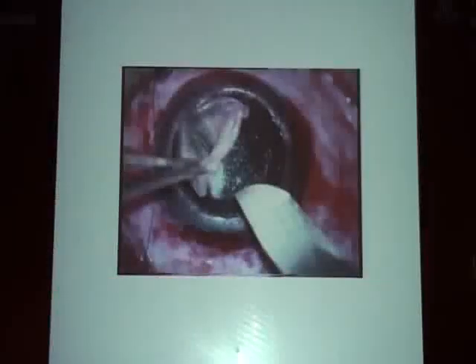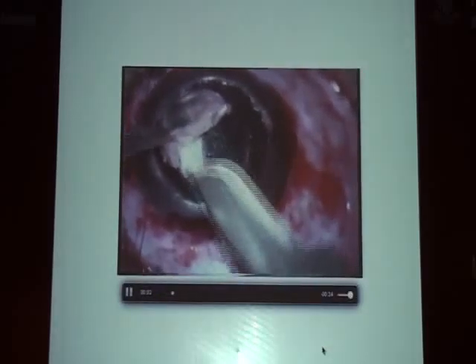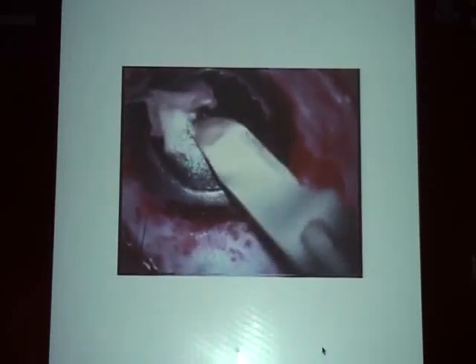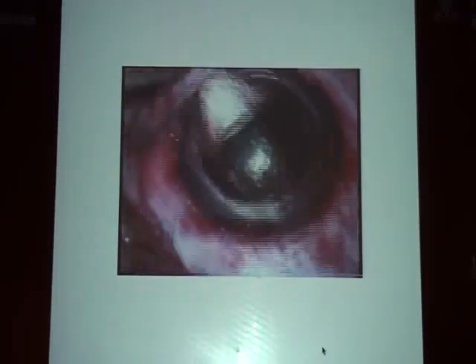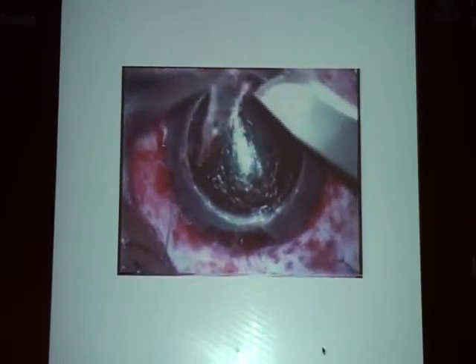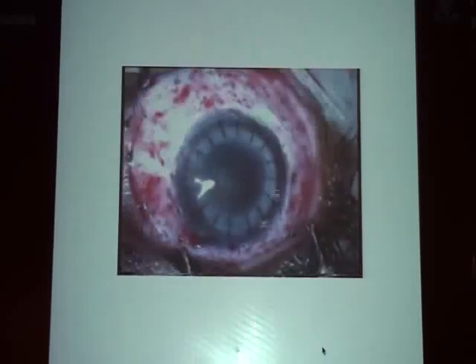Now, Rishi showed you some of the techniques, and this is one of the surgeries where, in chemical injury, because the anatomical landmarks are not properly defined, sometimes you would use a manual technique where you go layer by layer, and as you reach the deeper layer, you can realize that this is quite a depth because you are able to peel off the cornea, and that's the end point, so you shouldn't attempt to go deeper than that.